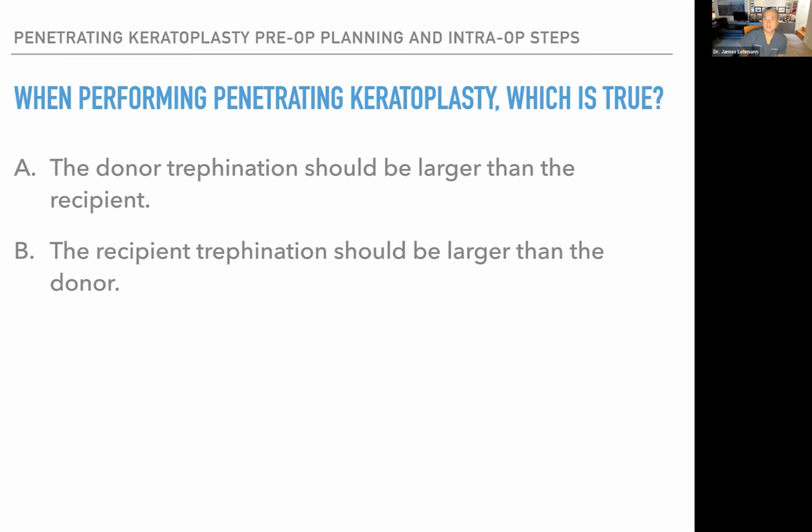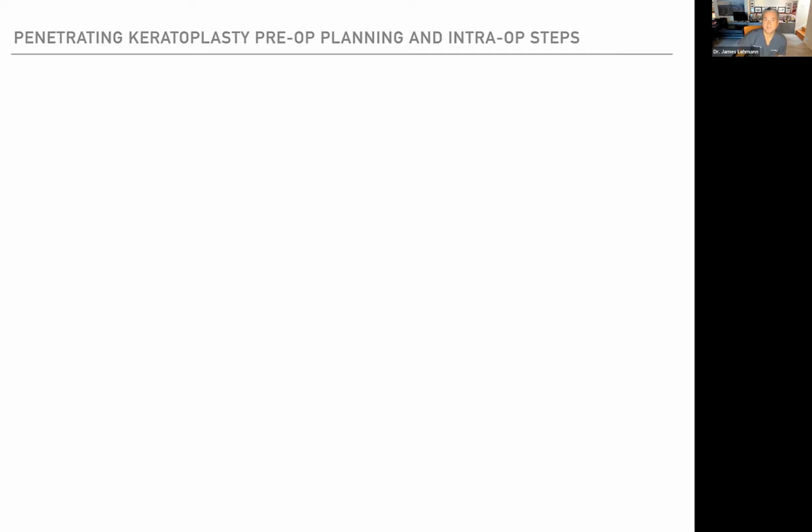When performing penetrating keratoplasty, which of these statements is true? The donor trephination is larger than the recipient, or the recipient is larger than the donor? Go ahead and submit your answer. Okay, 83% of you guys got the correct answer there. The donor should be larger than the recipient.